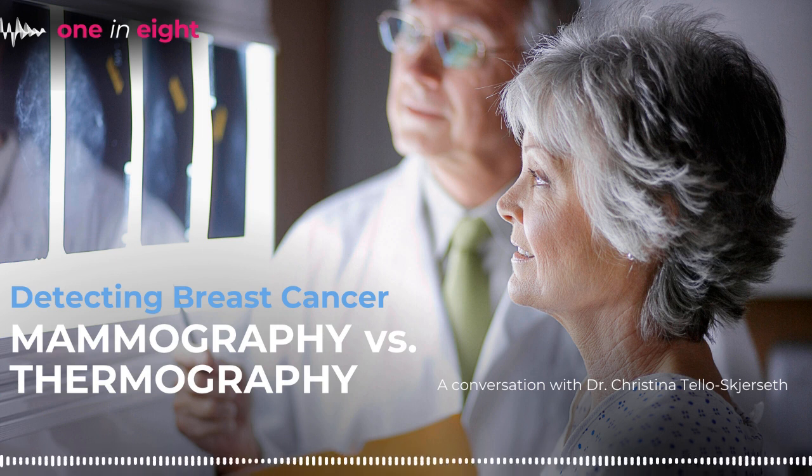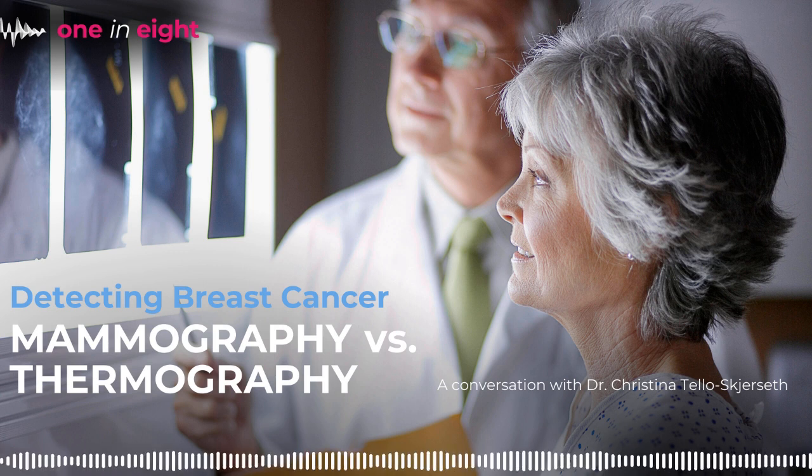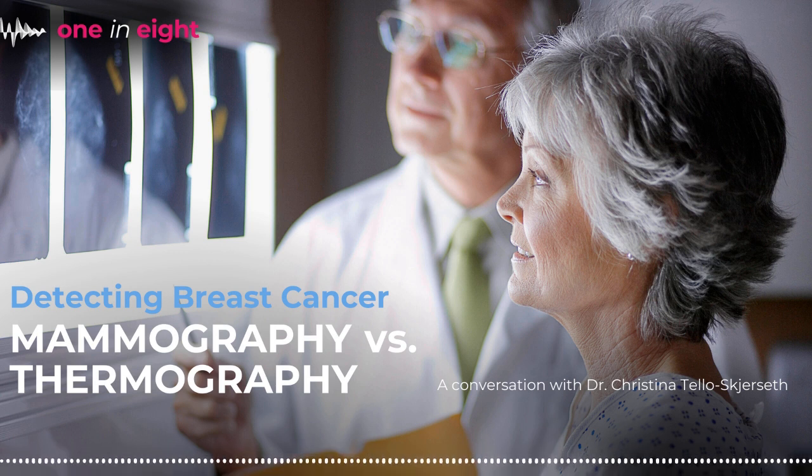Now, the research behind thermography, most of the data out there is from the 70s and 80s. There's really no recent information about it showing that it can actually detect breast cancer. And the FDA actually will put out warnings to facilities that advertise thermography as a breast cancer detection tool. It's really not what it's used for. It's approved to be used in addition to another type of screening or a diagnostic test, not a standalone tool.